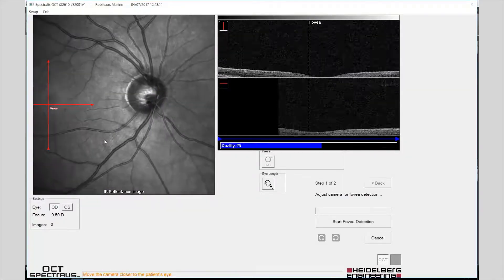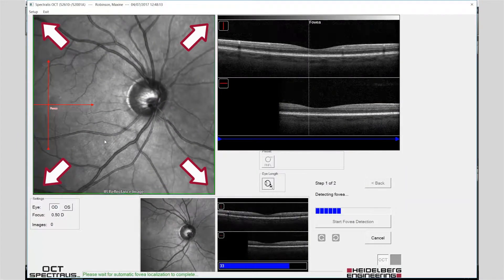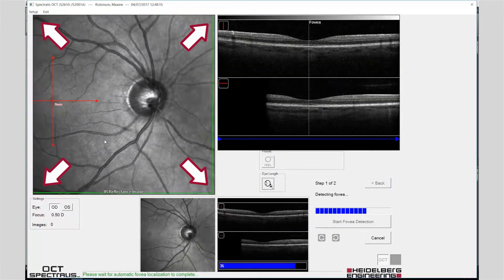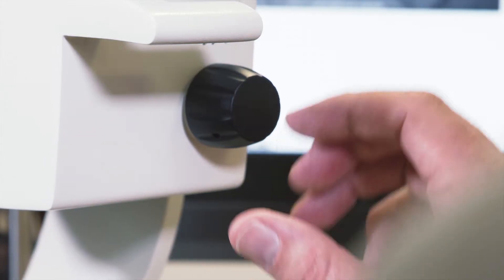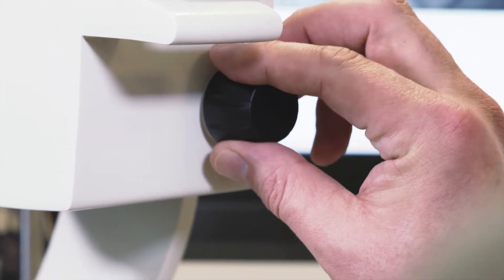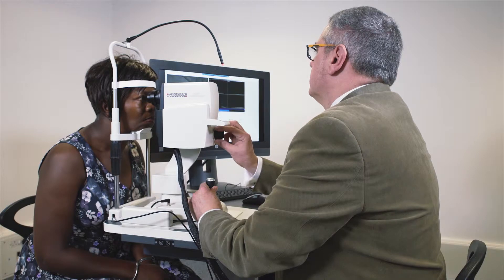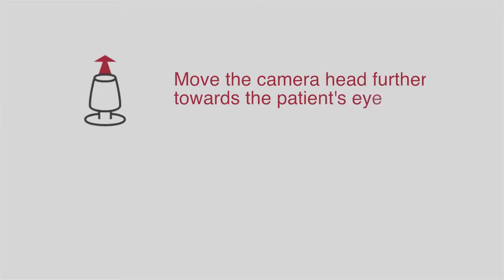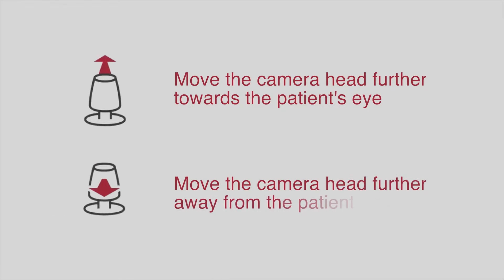The fundus image should be evenly illuminated from edge to edge, checked for sharp focus and adjusted accordingly. The software will provide visual guidance to indicate correct positioning of the camera.